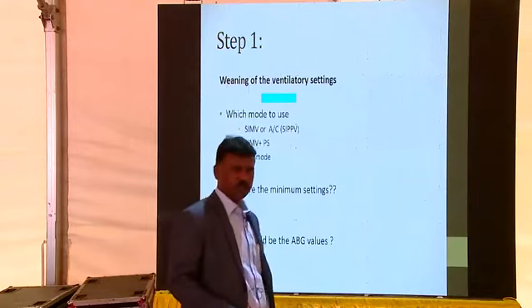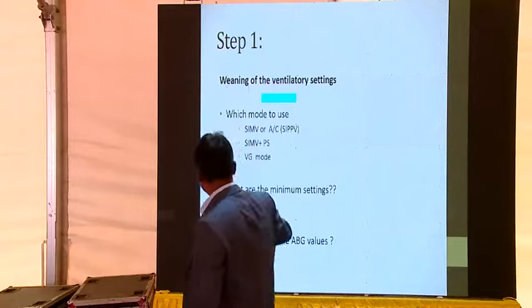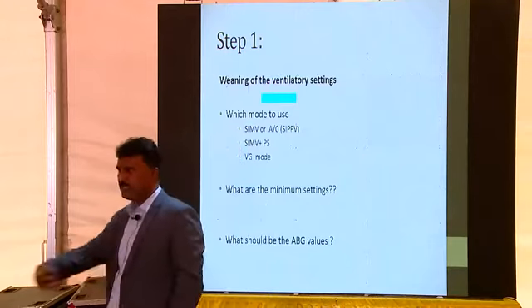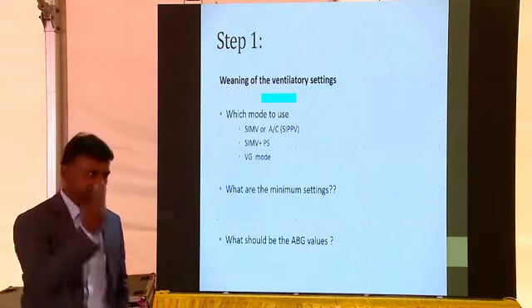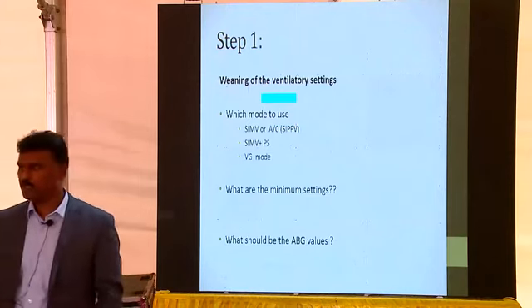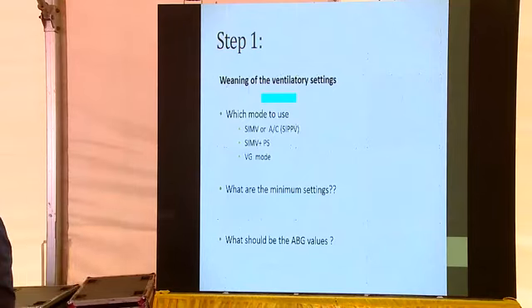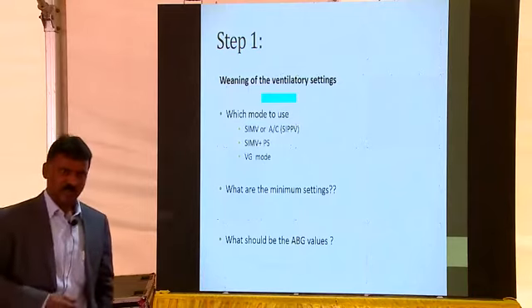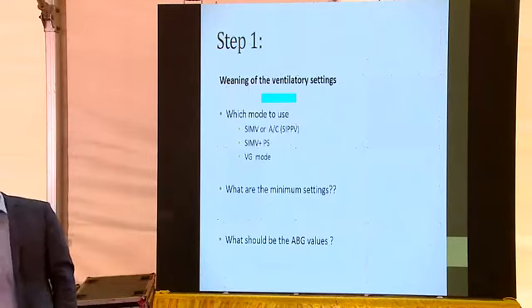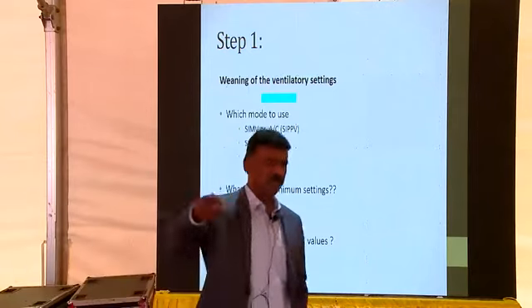So the next question is, now I have a baby in the hospital, around 1 kg, who has come down and, in my experience in the unit, would have been on IMV. The point is, how do I know this baby is ready for extubation? Is it just pulling out the tube really comfortably? So what is the concern when you are extubating the child? My worry is, will this baby be able to continuously breathe?